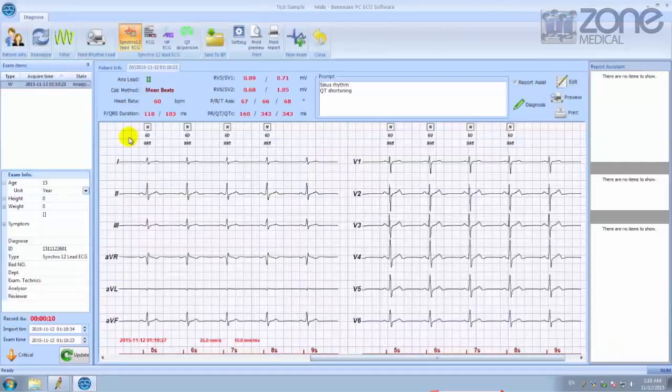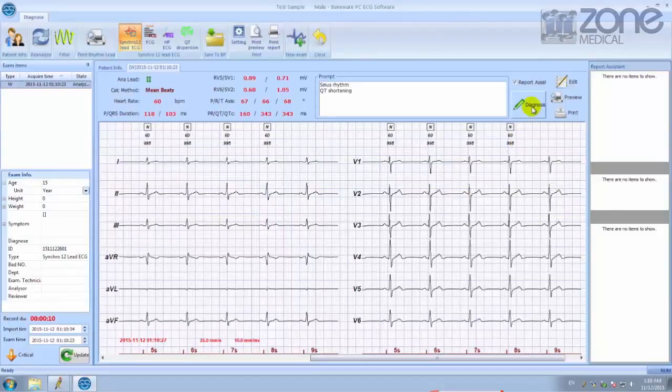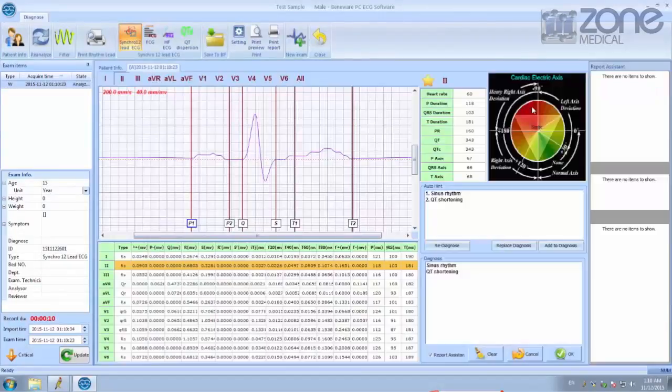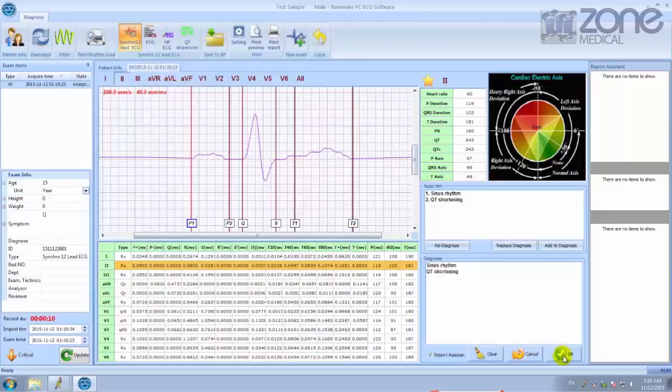Once you're in the results, you can get a general diagnosis of the test that was just run. This is what the screen will look like, and once you're finished you can click OK.